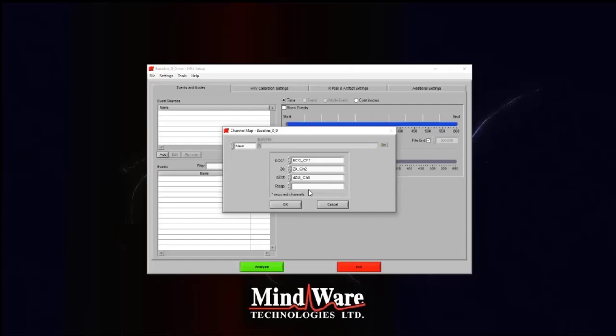One of the additional benefits of impedance is that we can also derive respiration. Respiration is, in some regards, going to be very important when we're validating some of the high frequency heart rate variability metrics, such as RSA or even RMSSD. And so we definitely want to ensure that in most cases, we collect respiration along with the ECG data. That's usually very critical. If this is not done, there can be a lot of questions that you can't really answer, and then you'll basically be funneled into having respiration as a covariate.